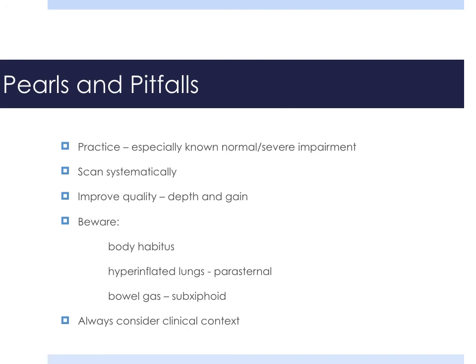You need to scan systematically. There is clearly a learning curve, and regular scanning will make your skills better. Always remember to improve the quality of your scan, adjusting depth and gain, and always be aware it's challenging to scan in intensive care. It all depends, with more challenges with different body habitus, hyperinflated lungs, positively ventilated patients, and patients with chest drains or a distended abdomen for some of the views.